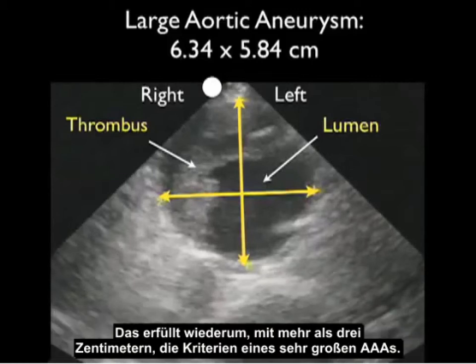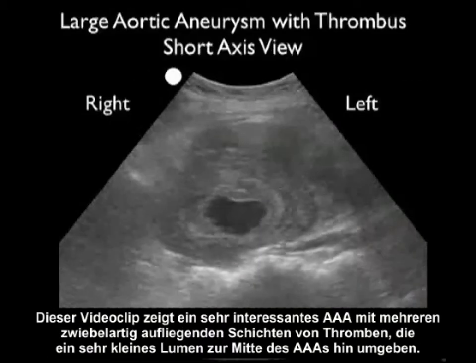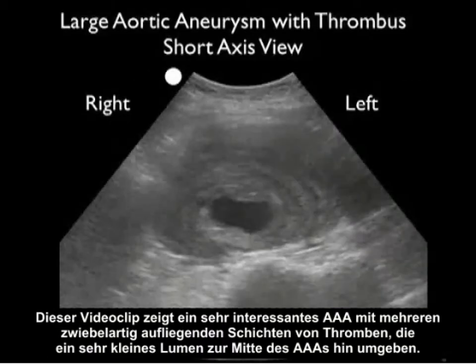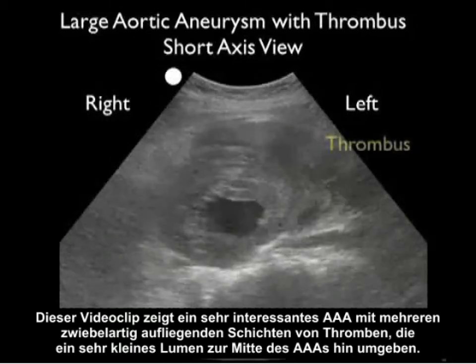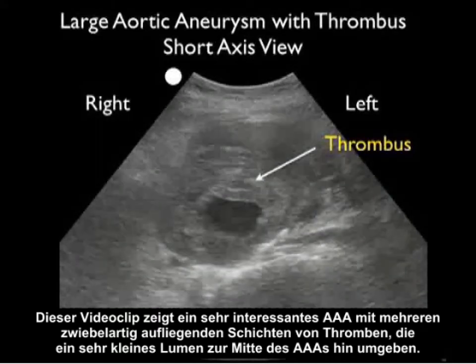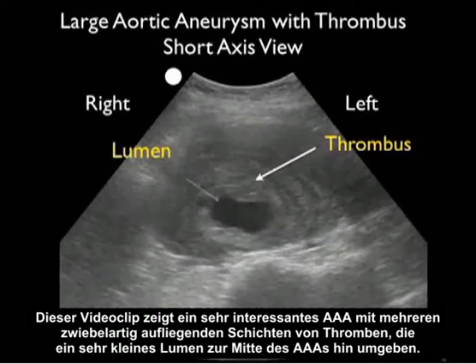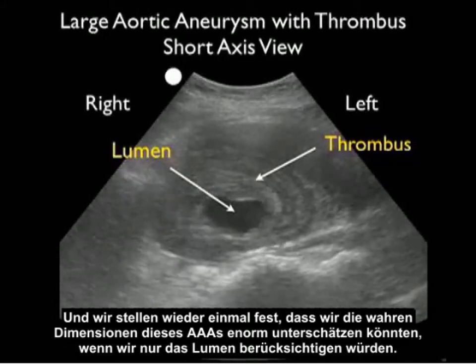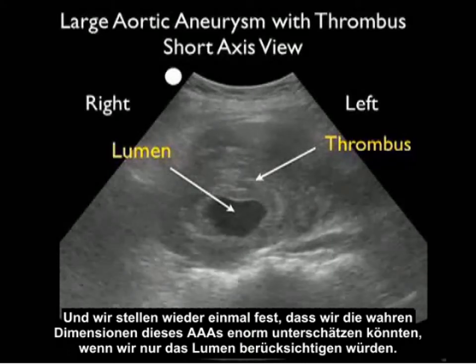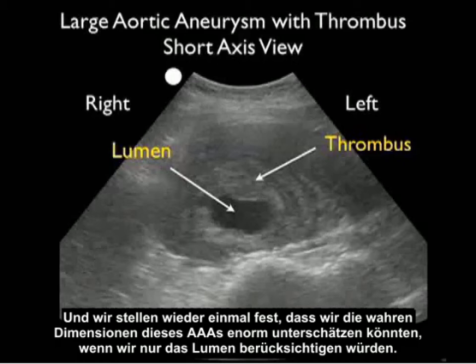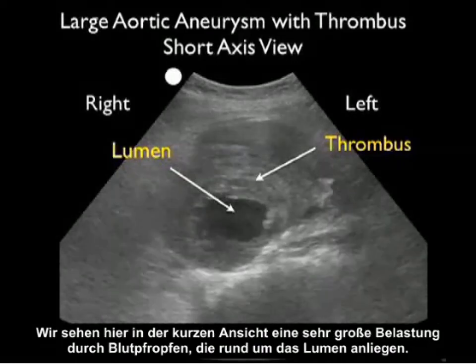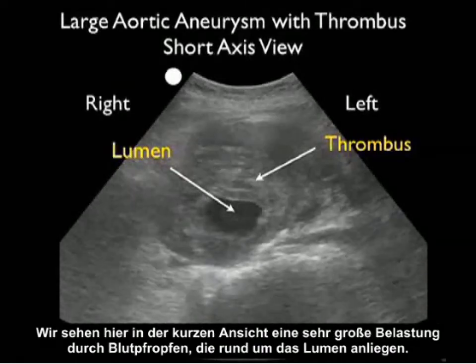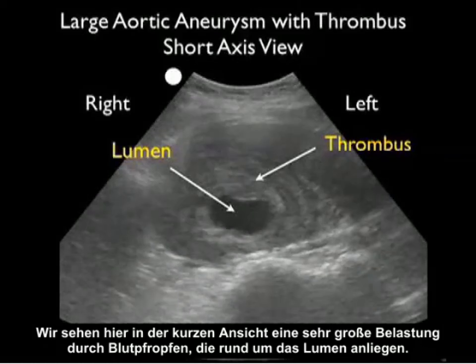This video clip shows a very interesting AAA with multiple onion skin layers of thrombus surrounding a very small lumen towards the middle of the AAA. Notice again that we could vastly underestimate the true dimensions if all we included was the lumen. We see a very large burden of clot surrounding the lumen circumferentially in a short axis orientation.